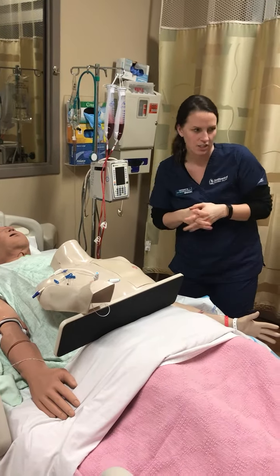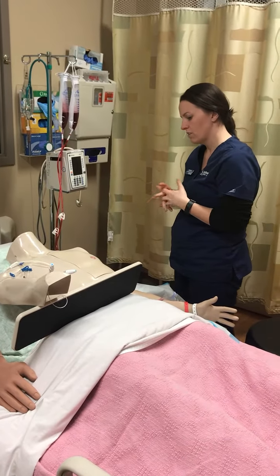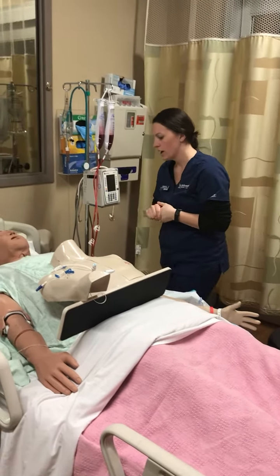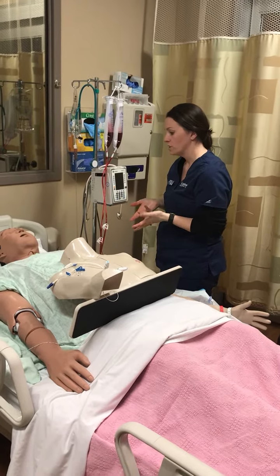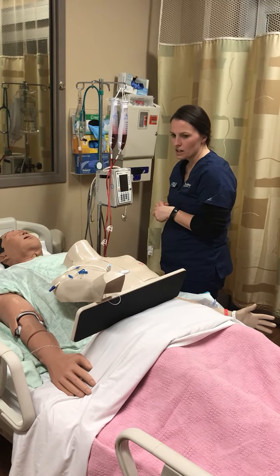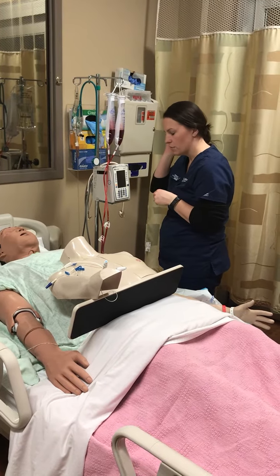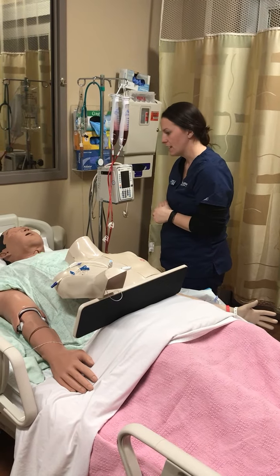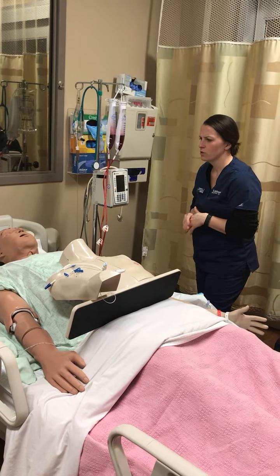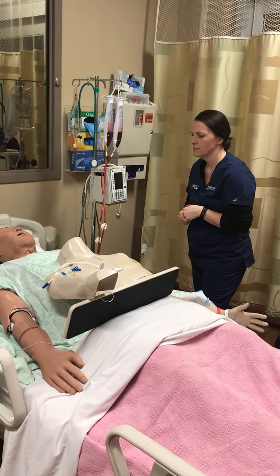And she says yes, she has been feeling nauseated. Okay, so we have that ordered for you, so I can go ahead and give that to you through your PICC line that you are using currently for your long-term antibiotic use. So we will be able to just go ahead and administer it in that same PICC line. Do you have any allergies that you know of right off the bat?